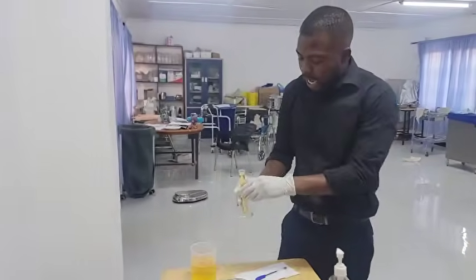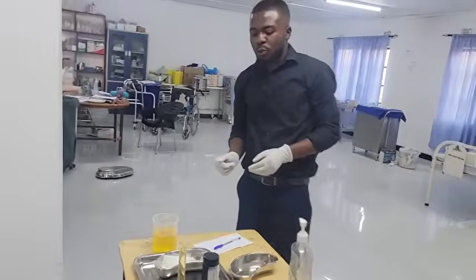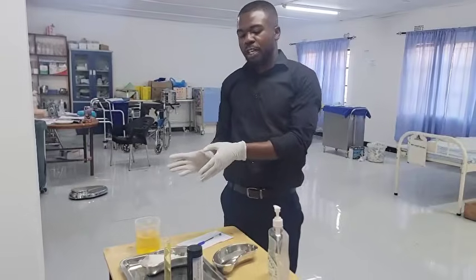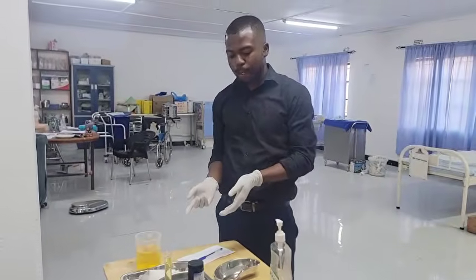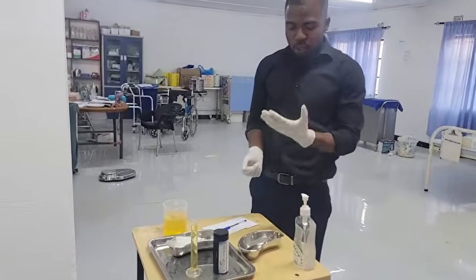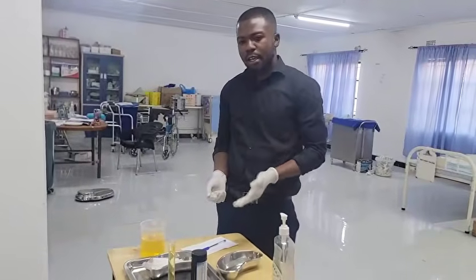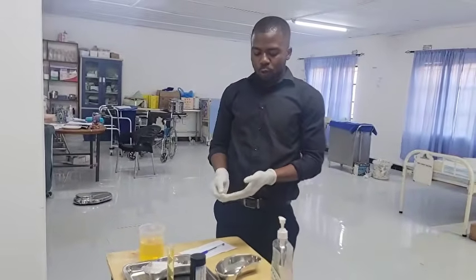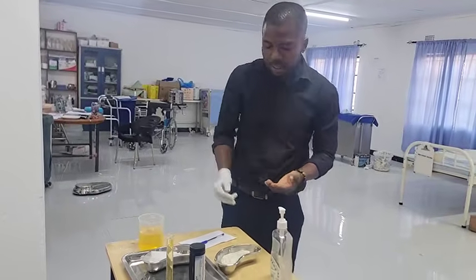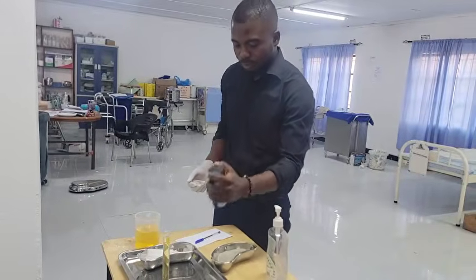After you do that, the next thing is to concentrate on the chemical properties. We are done with the physical properties, so let's now look at the chemical properties of urine. Remember I said there are issues of contaminating the bottle itself. So you are going to remove this glove, and then use this hand to open the bottle. So you do this.